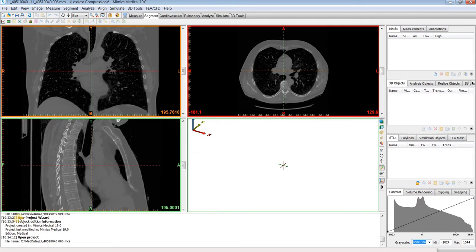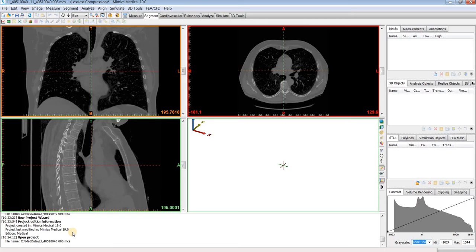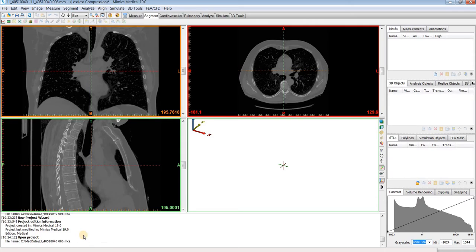Down here at the bottom is our logger, which will keep track of any actions that we perform. It will also keep track of any undos that you do, so inevitably you might make a mistake, and as you hit CTRL-Z or the undo button, it will let you know which action you're actually undoing, just to make sure you're not undoing something that you actually don't want to.